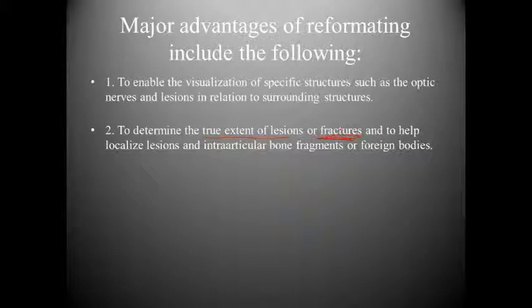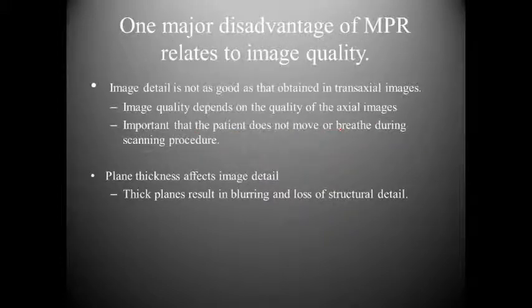So it greatly helps and benefits people who are going to be undergoing surgery, or if you have foreign bodies located in an area of the body, it allows you to see where they are and how deep they are in relation to specific anatomical structures. So it gives many physicians an excellent jumping-off point so that they can see what they're going into. However, one major disadvantage of MPR relates to the image quality.